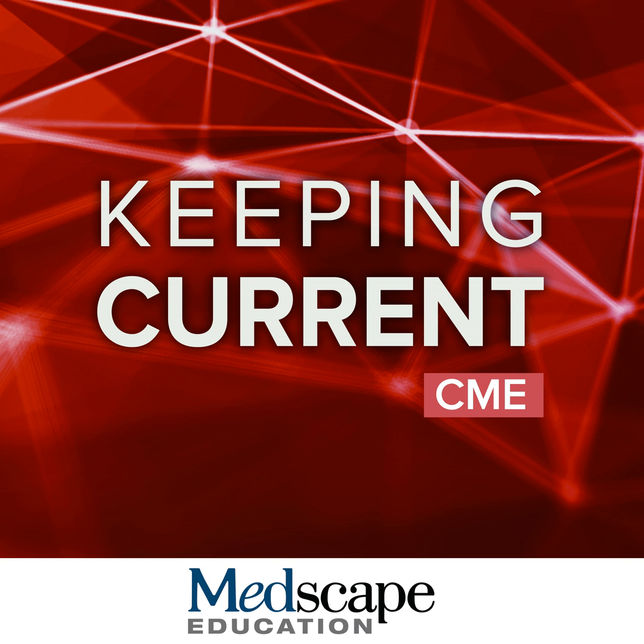The second is in the interpretation here. So one of the rules of thumb we use when we're interpreting chronic infarcts is to describe the transmural extent of the infarct. And you can see in case number one here on the bottom that the entire wall is involved by the infarct. So it is transmurally enhanced.